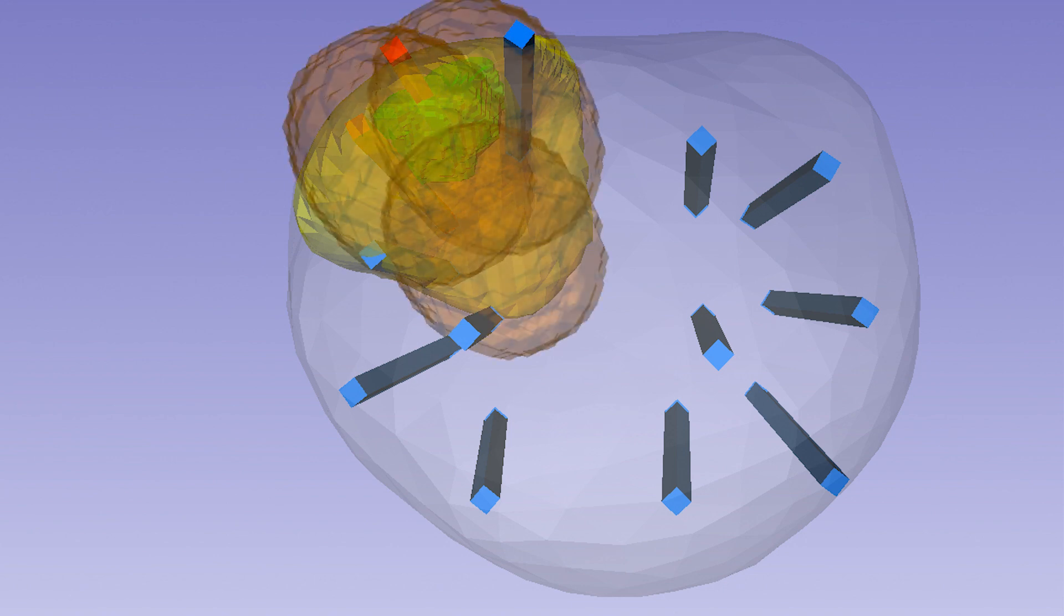The ablations are overlapped to ensure there are no gaps in treatment and positioned to treat beyond the prostate to compensate for capsular cooling. A good plan should minimize damage to the urethra. Once the physician is satisfied, this patient-specific treatment plan is loaded onto the Orion for visualization during the procedure.